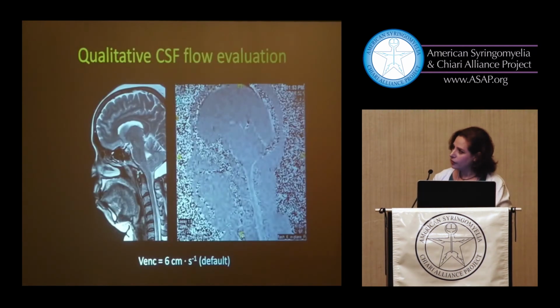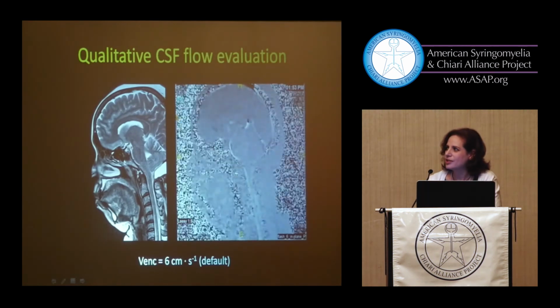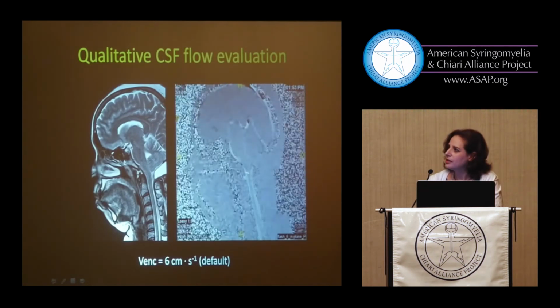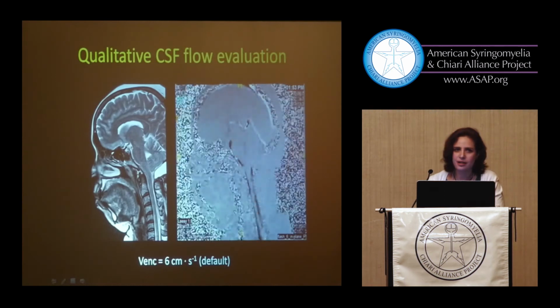We looked at the flow for this case, and I'll show you what it looks like, if I can get my mouse back. Here. We did the flow, and there's this region in front where there's no flow. And I think this may have been read as sort of a block, because it certainly looks like there's something blocking flow over here. But I looked at this, and there were a few little telltale signs, which we can go over later, that told me I think that's not really a block. But with this image, I can't tell you anything.